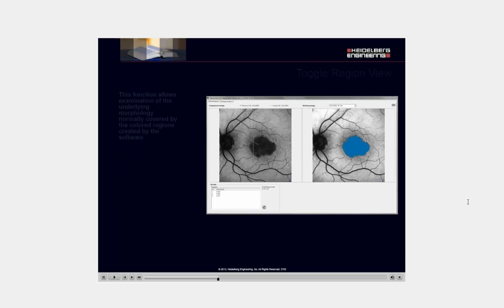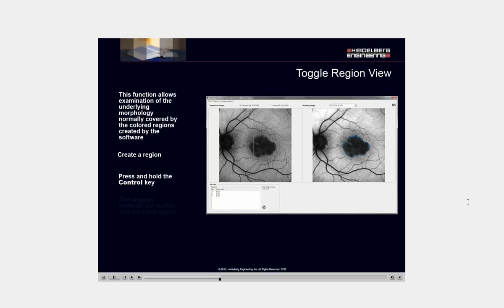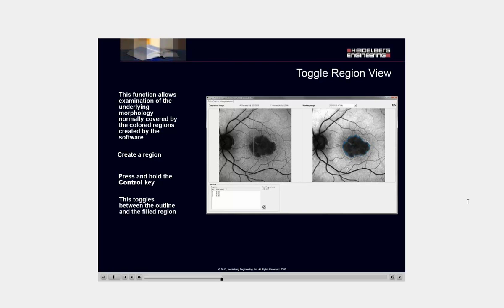This function allows examination of the underlying morphology normally covered by the colored regions created by the software. Create a region. Press and hold the Ctrl key. This toggles between the outline and the filled region.